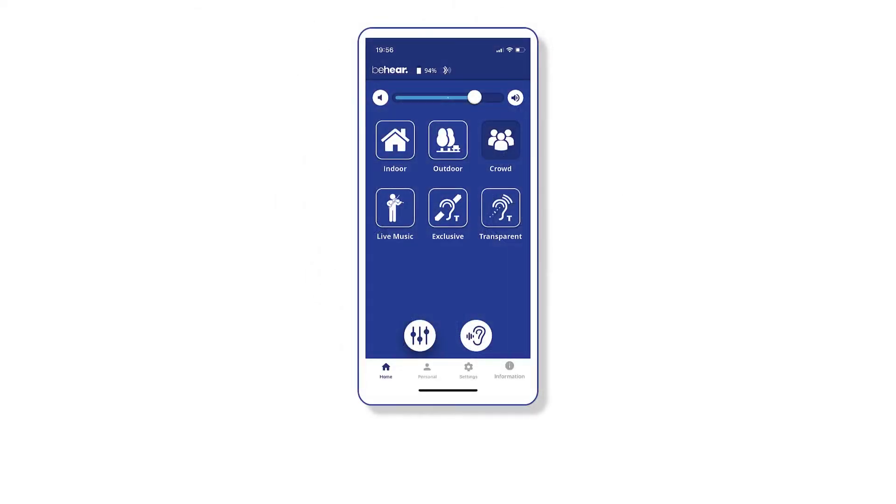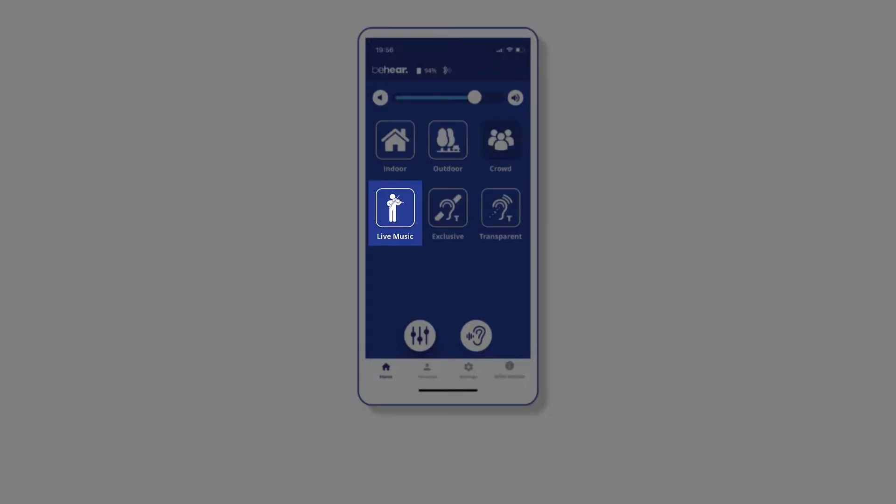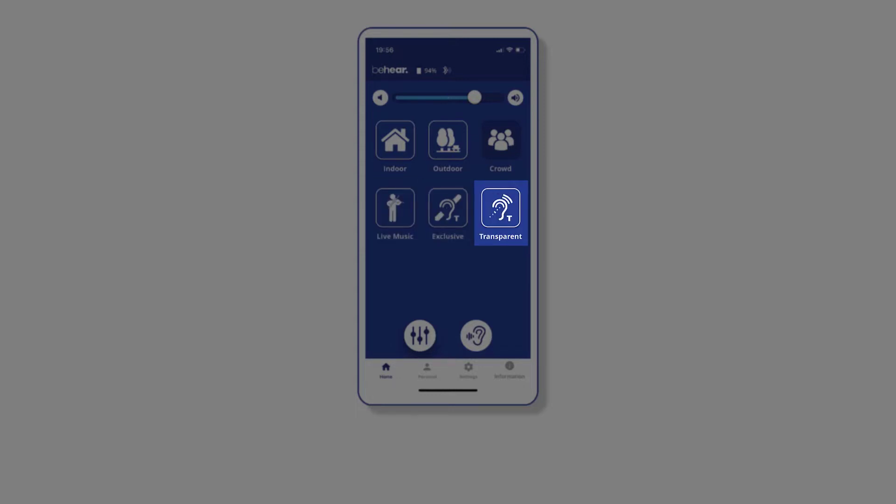The headset comes pre-programmed with settings for six different hearing modes: Indoor, Outdoor, Crowd, Live Music, Telecoil Exclusive, and Telecoil Transparent.